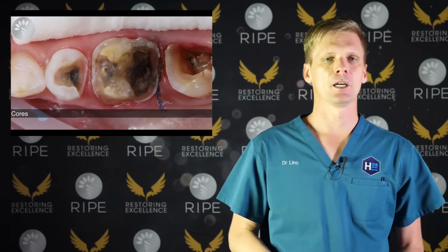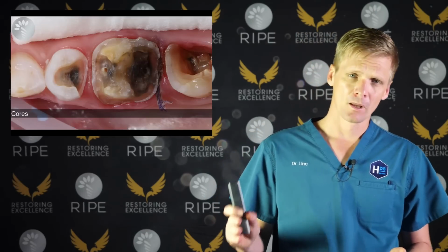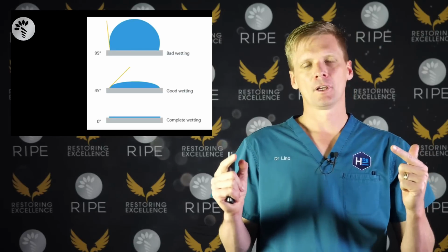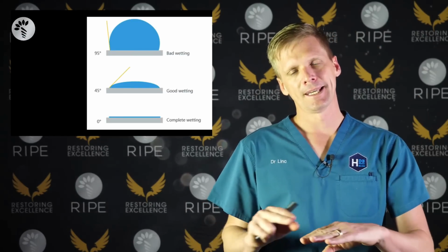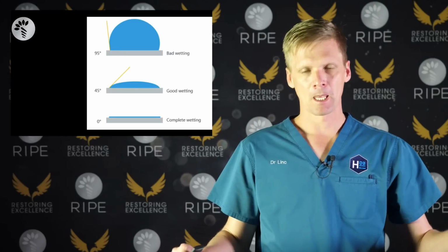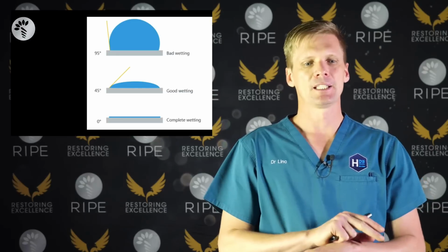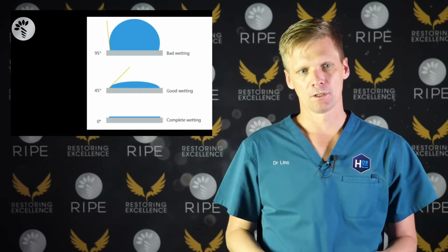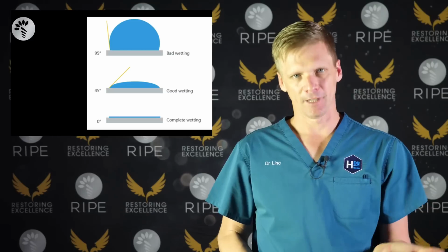I've got plenty of time to bond a core. Now, here's the problem. When you have a hydrophilic substance on a hydrophilic surface, it's better if it's rough. But when you have a hydrophobic substance on a hydrophobic surface, it's better if it's smooth. So the contact angle of the silicone with the tooth is actually affected by how rough it is.